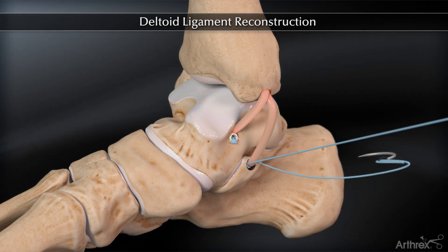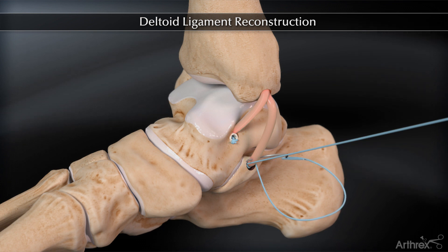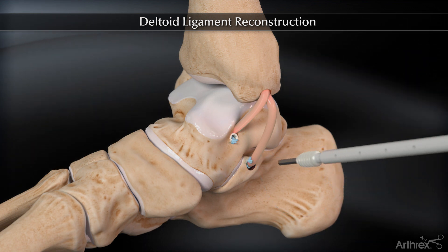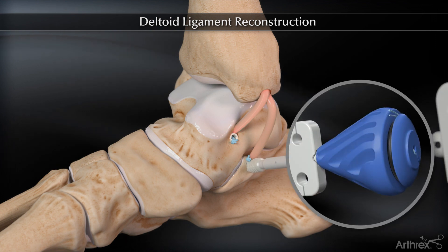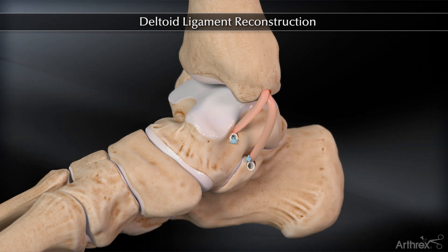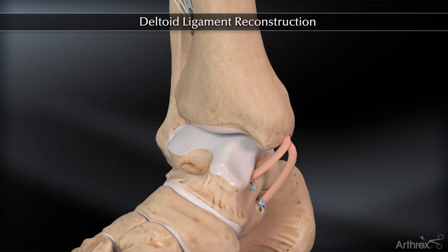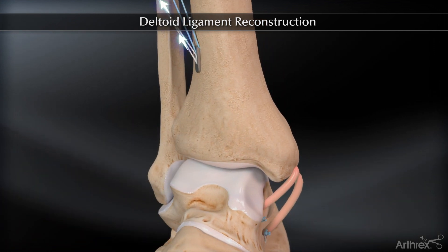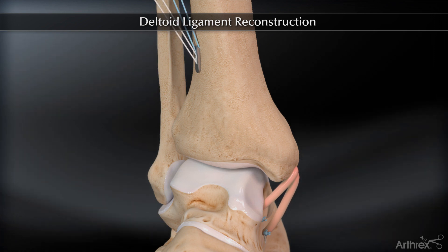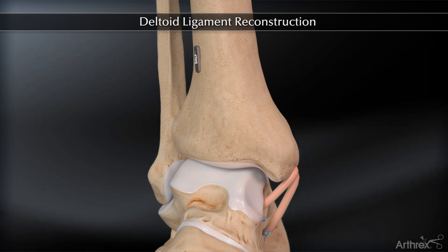Securely suture the tendon at the calcaneal tunnel entry using a free needle. Finally, insert the tenodesis screw into the calcaneal tunnel for additional interference fixation. Final tension of the construct is achieved by once again toggling the white tightrope sutures exiting superiorly at the tibia. Once proper tension is achieved, the blue tightrope sutures are pulled out of the button and the white sutures are cut.